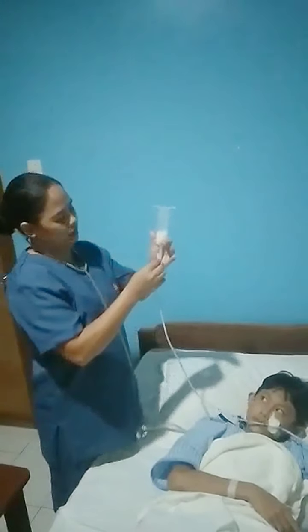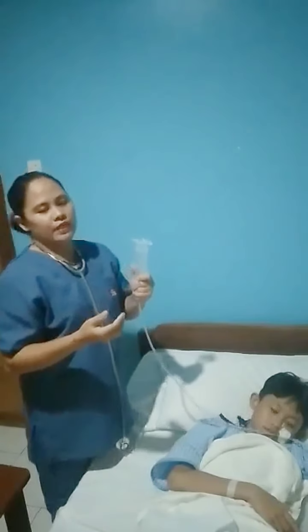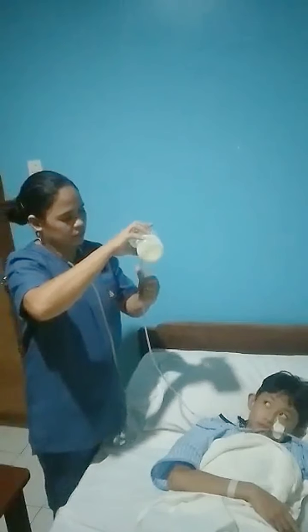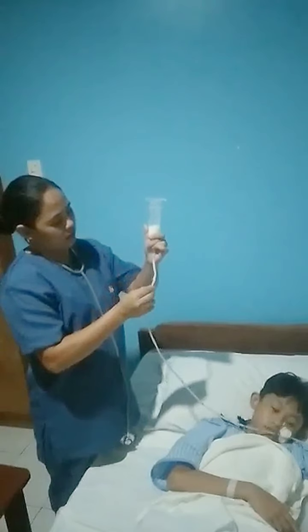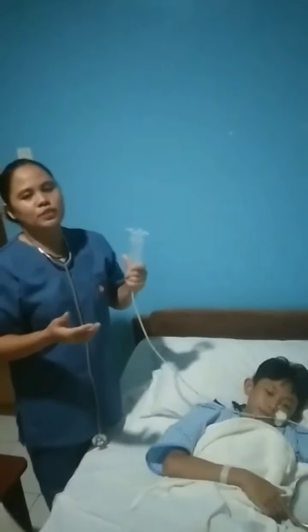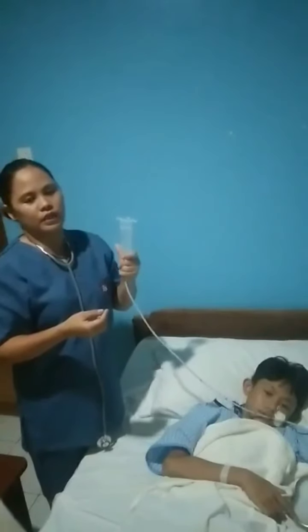Let go of the kink. Kink it back. And go on with your feeding again. Let go of the kink. Kink it back. Now let's proceed to the last flushing. The last 10 ml must be flushed in the tube to get rid of possible blockage that might have stayed during your feeding.